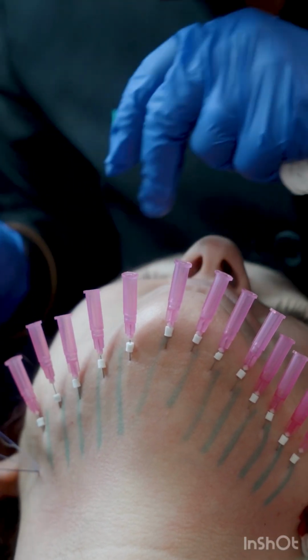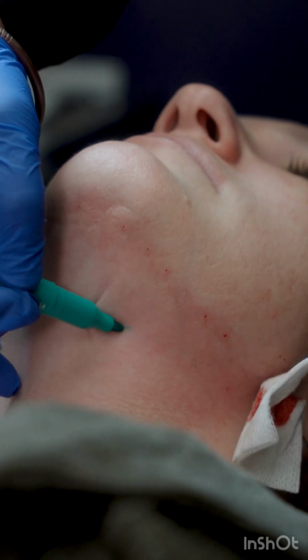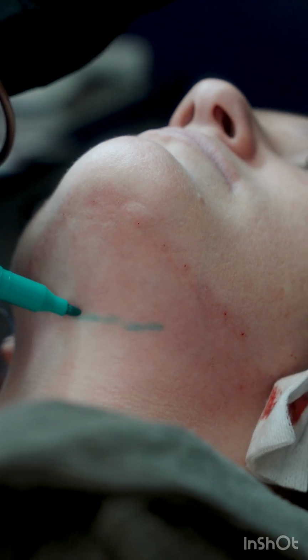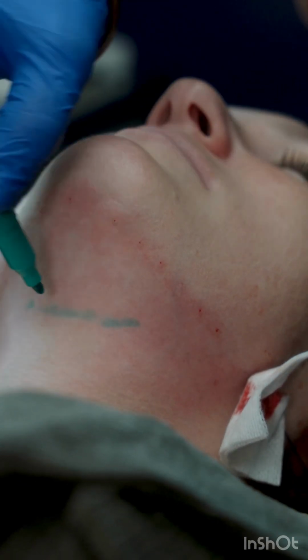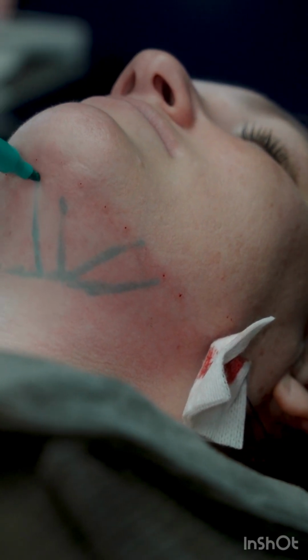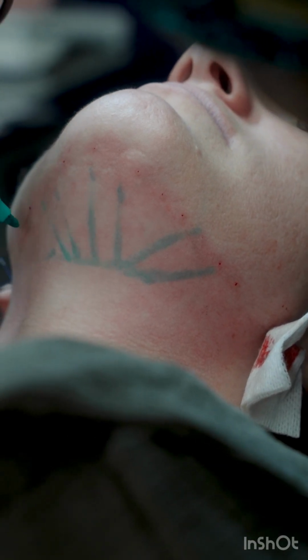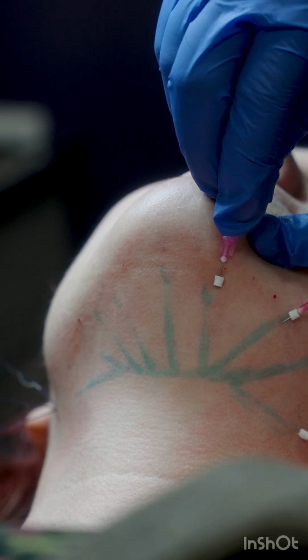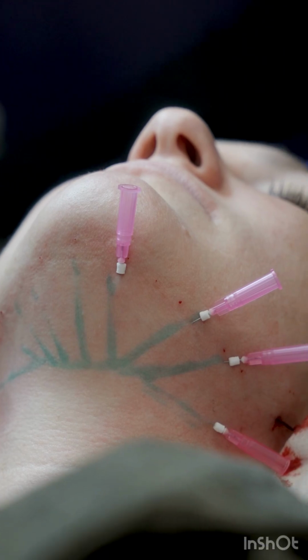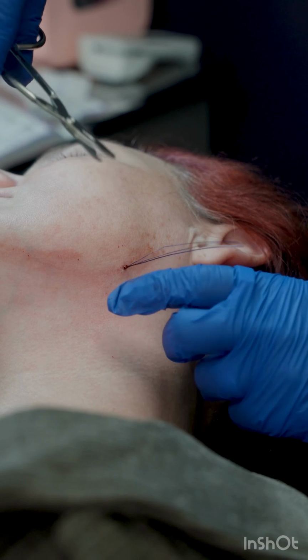Once all of the threads have been inserted, then we twist and lock them into place and pull out the hub. Now for additional treatment, I'm going to do what I like to refer to as a star burst or star ray pattern, where I am drawing on her neck in that submental region areas where I want to provide additional tightening because she had a lot of loose skin right in this area before we started. I again will insert smaller PDO threads into the area to help achieve more tightness.